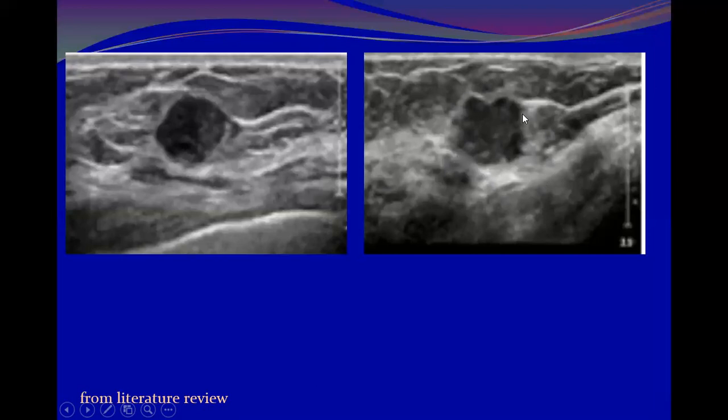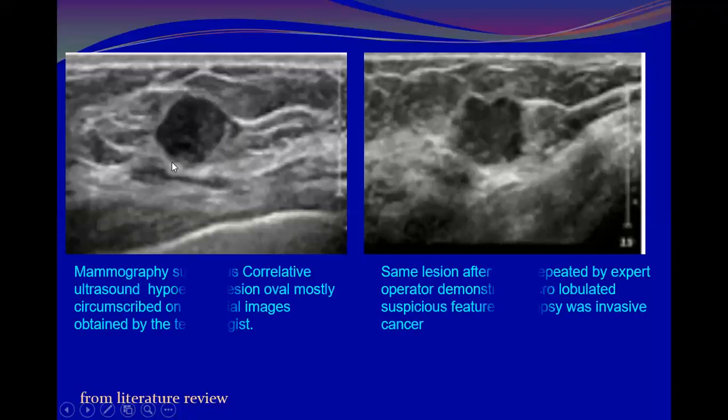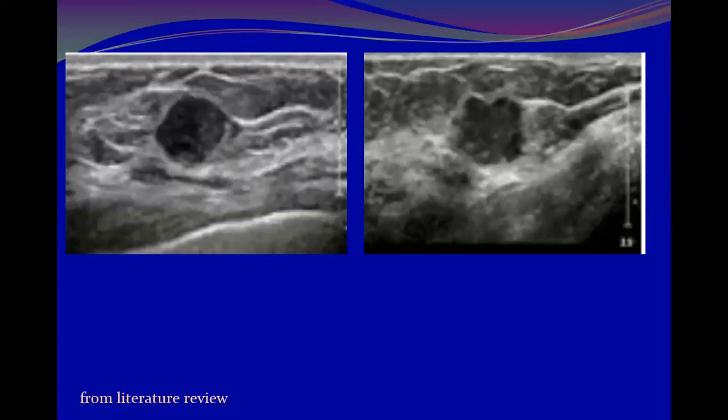This is almost BI-RADS 5. You will give this BI-RADS 4B. It's okay, accept it, 4B, 4A. Someone might say 3. It is mostly circumscribed, here might be an angular border, here maybe indistinct. So yes, but at least not the same grade.